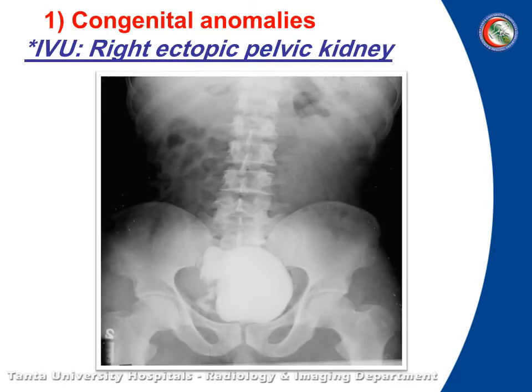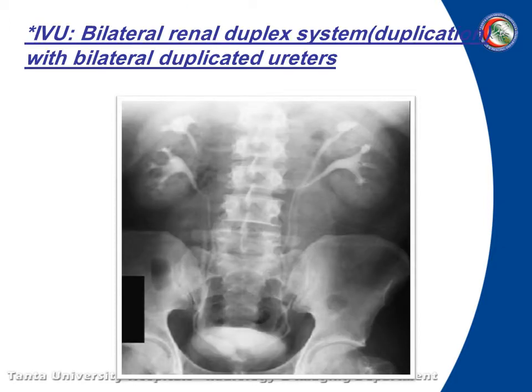In pathology, first we have congenital anomalies. First, right ectopic pelvic kidney — as you can see, there is a right-sided pelvic kidney. And here there is a duplex kidney — bilateral renal duplication, duplication of the calyceal system and duplication of both ureters.